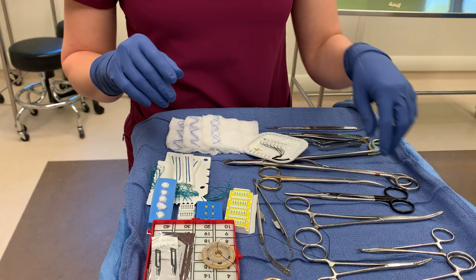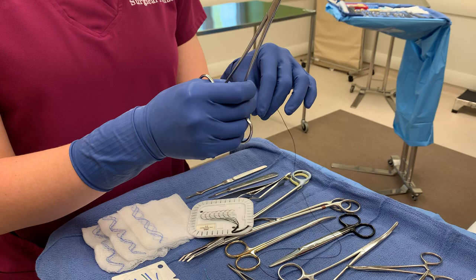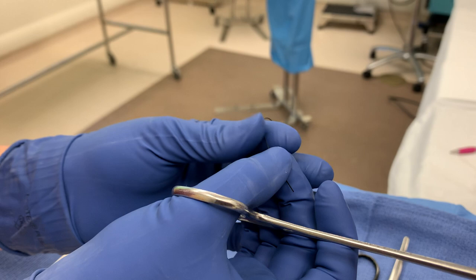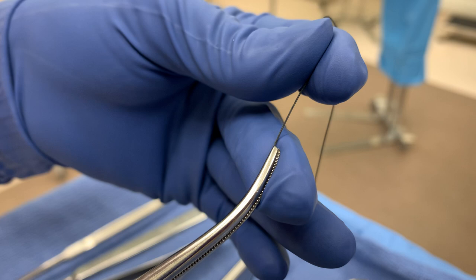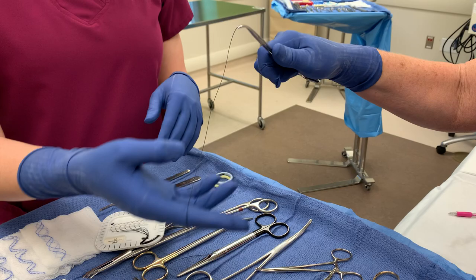Now we're going to go with tie on a passer. I'm going to take my tonsil clamp and add a free tie — so tie on a passer: it is attached to an instrument, and they will most likely use a tonsil. The way I do this — I put it between my index finger and my thumb, stabilize the instrument on my middle finger, so I can put it right where I need to. It's coming out of the tips of that instrument just like that.